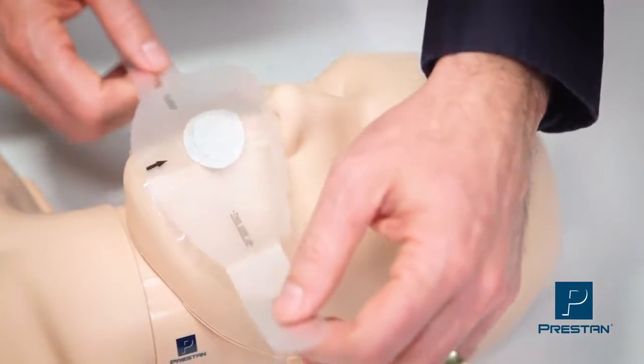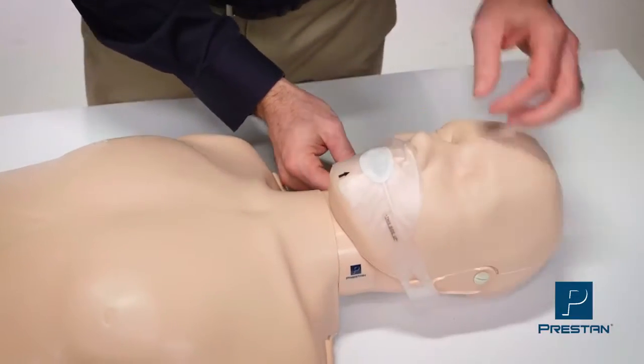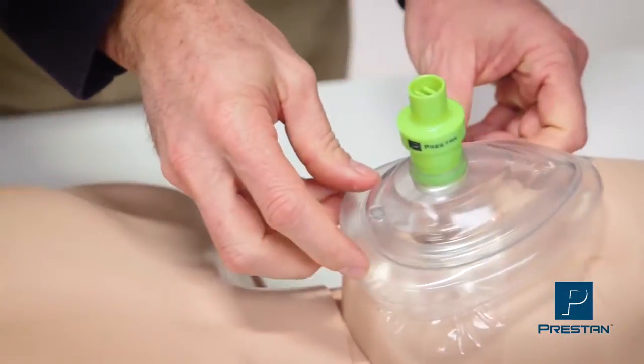If students will be sharing a mannequin, you can provide individual Preston face shields which secure to the ear pins. Or if you're using a CPR training mask, Preston offers CPR training valves.